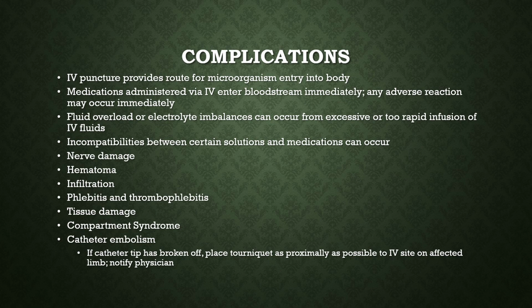Infiltration occurs, as you probably know, when the IV infuses not into the vein like it's supposed to, but into the soft tissue around the vein. That's called an infiltration. The fluid is not meant to go into the soft tissue. It's meant to go into the vein. It can be very dangerous to have an infiltration, especially if it's certain medications that are tissue vesicants.